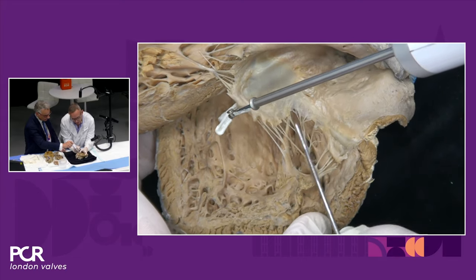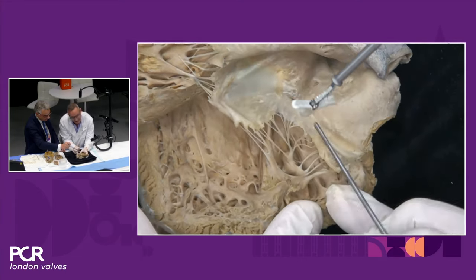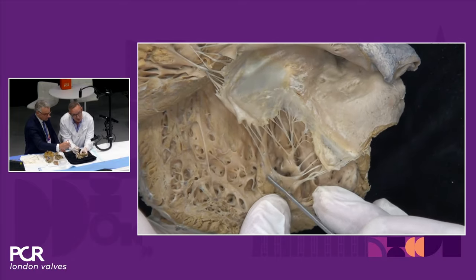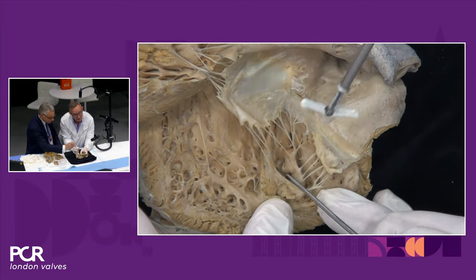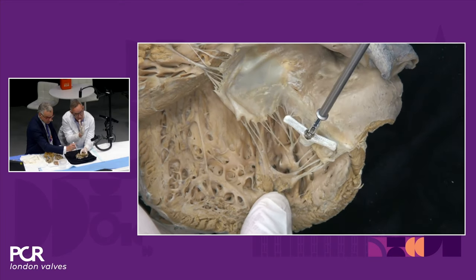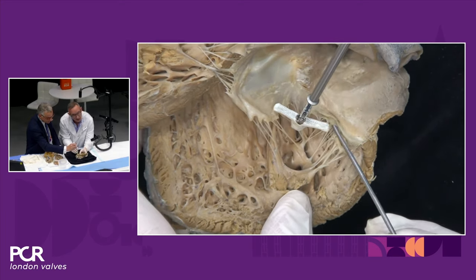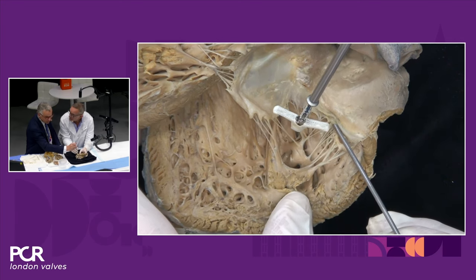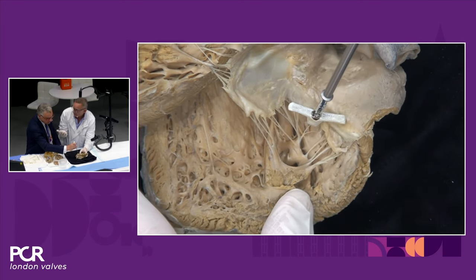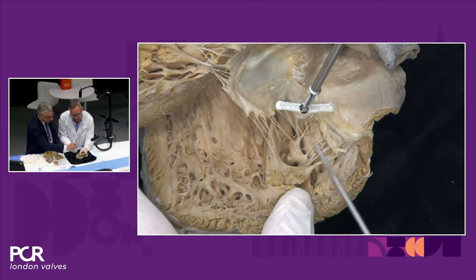Alternatively, if you're in this region, more inferior first, then you can see that the heads of the papillary muscles fan out like the fingers of your hand, and they give rise to those cords. So they're really curving in an arc. That's why it's much more complicated to grasp in this location. And as you find, you've then got to be very careful how you manipulate the clip afterwards.